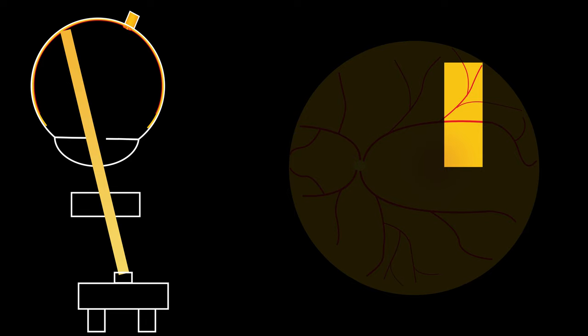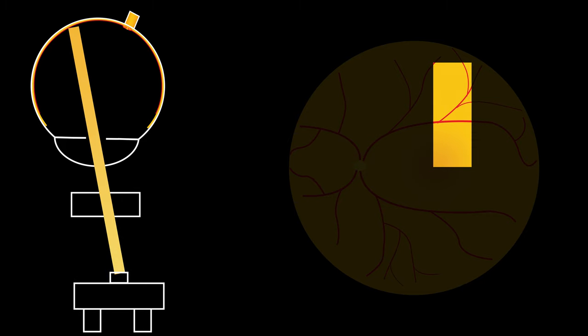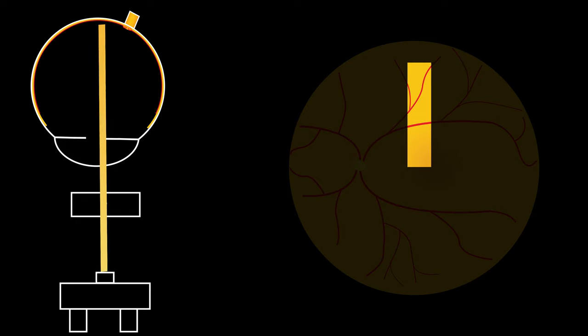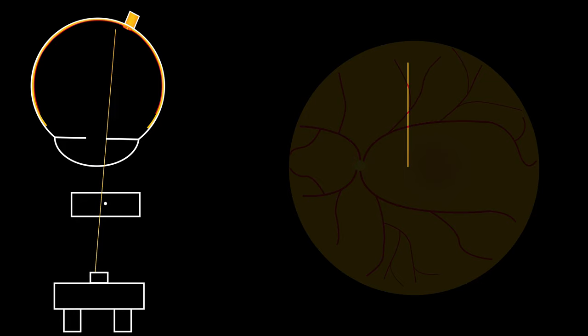Let's say you're here and you want to find the optic disc. The vessels are telling you to go to the left and down. If you move your slit lamp to the left you're going in the right direction but after a while you start to see less and less until your image is dark. This is because you've reached the pupil margin and the iris is blocking your view. So what can you do against that?